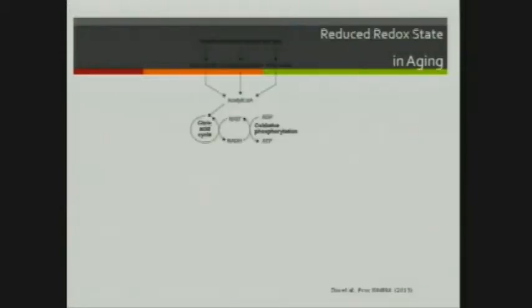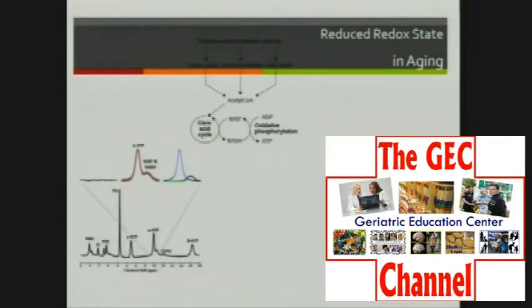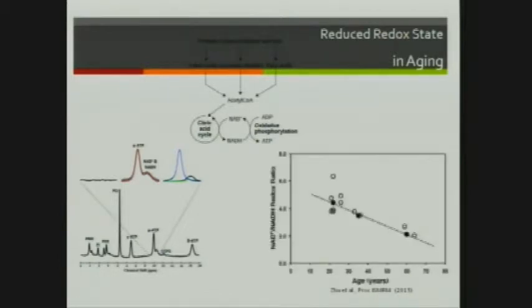The next study giving us a similar answer measured with P31, phosphorus-31 MRS. It can tell us not only the ATP production rate, but also give us the redox state, which is the NAD to NADH ratio. And this modulates the TCA cycle. So the ratio changes can also change the TCA cycle flux and also change the ATP production. This is also a newly developed technique, and it shows that with age, the redox state also changes.